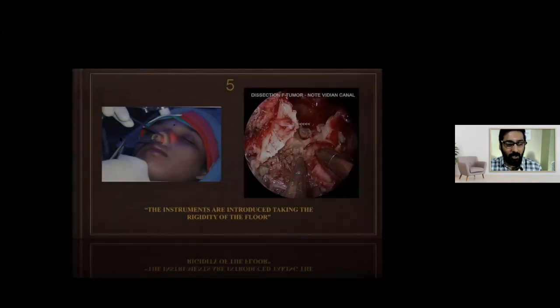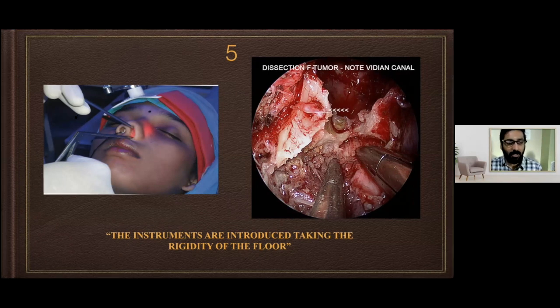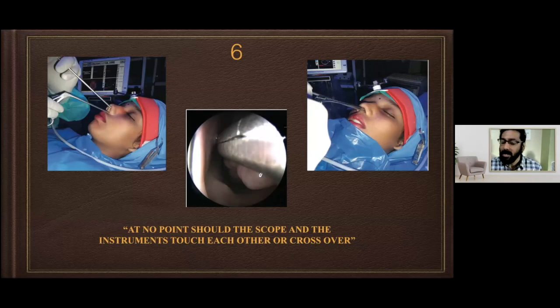And the instrument should always be on the floor. That's very important. These two should not cross over. If they cross over, you will have what is called the crossover effect. And see, that's a crossover effect. When you do that, you will have a problem during surgery. The instrument should never be above the endoscope. If you have the instrument above the endoscope, then you're doing something wrong in endoscopic skull-base surgery.